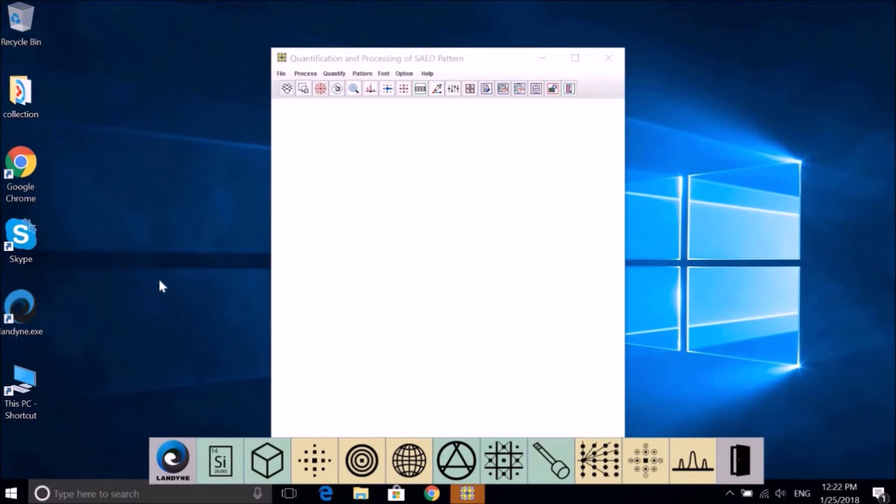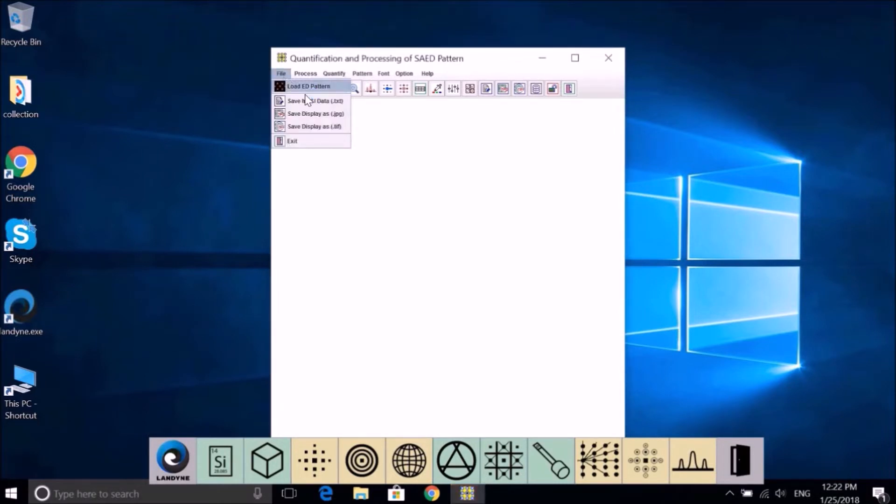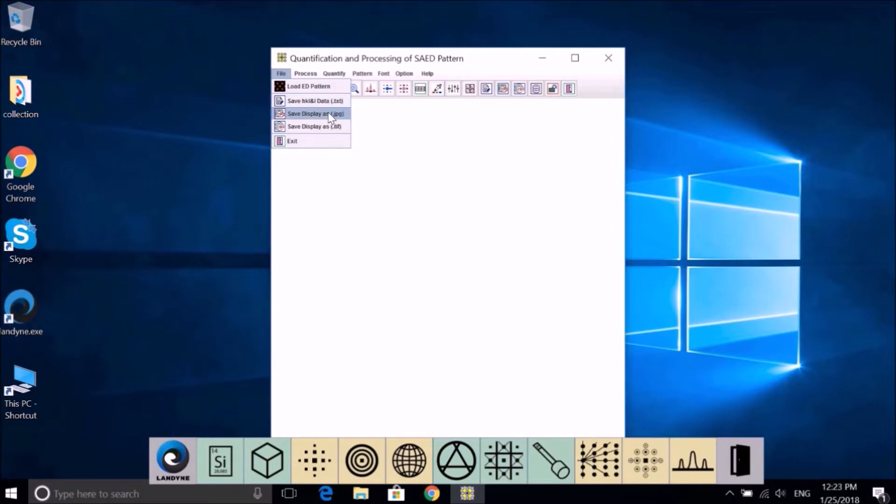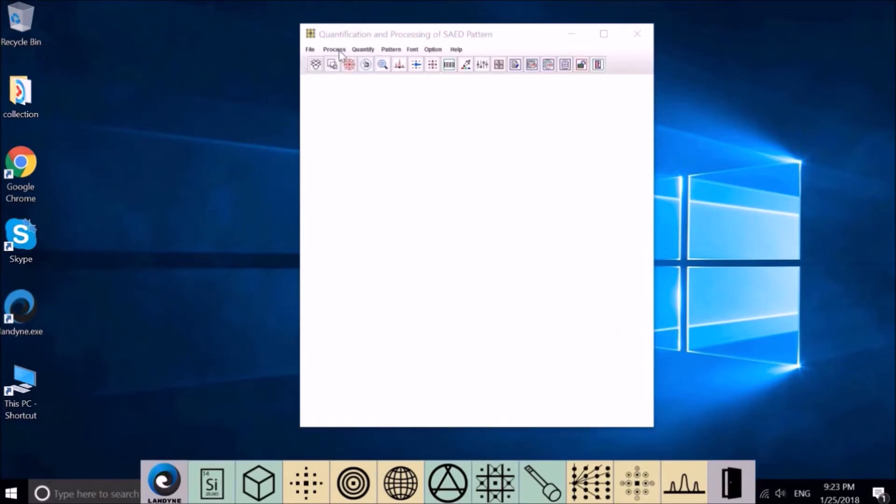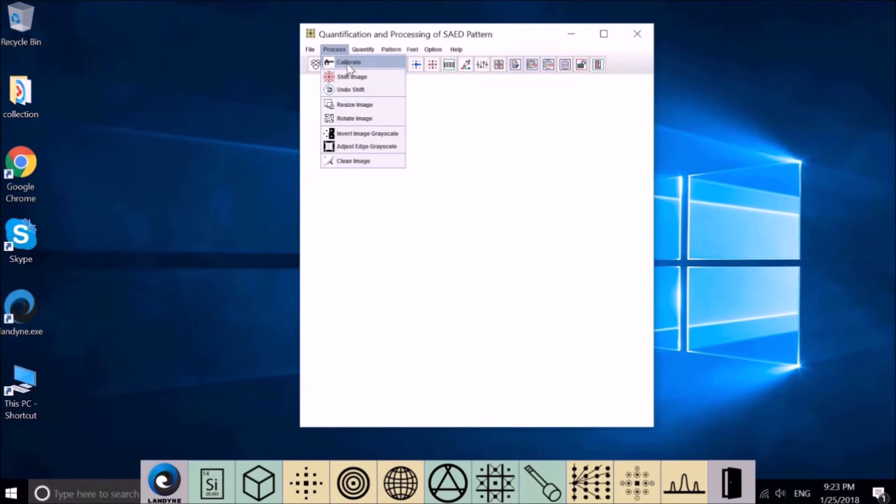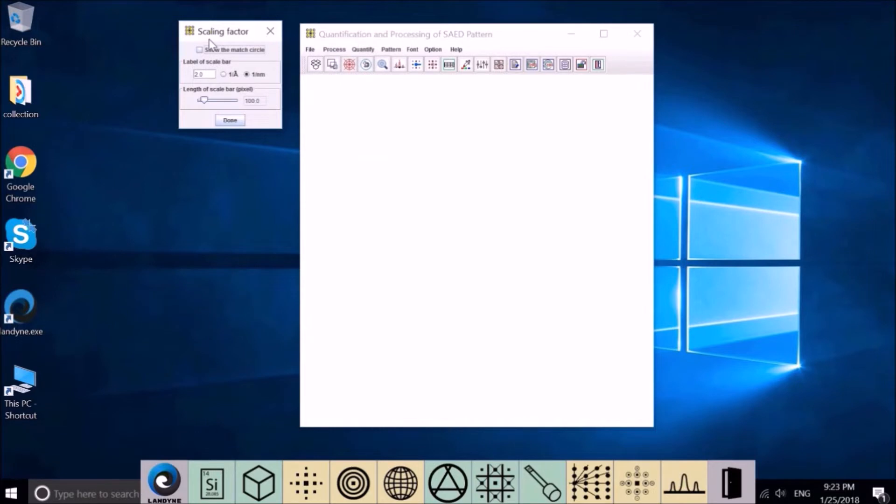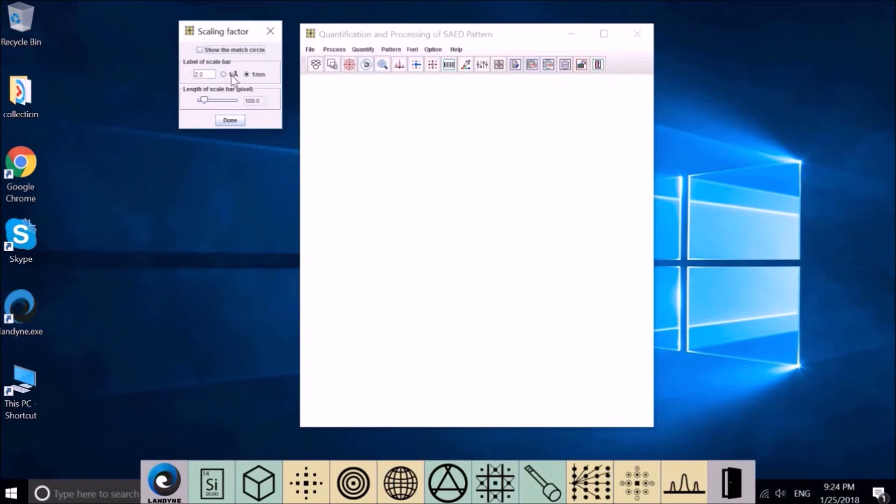Let me introduce the functions on the menu bar. File: load electron diffraction pattern, save HKL data, save display as JPEG, save display as TIF, save, exit. Process: calibrate scaling factor, which is used to measure the basic vector or the length between diffraction spots.